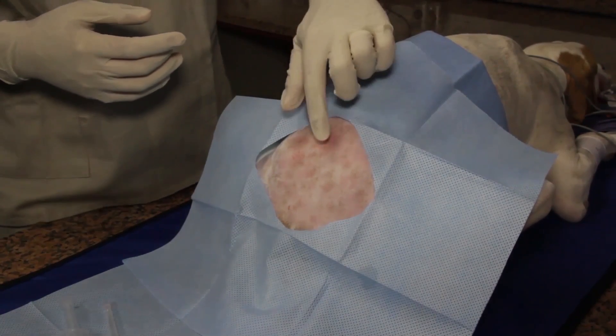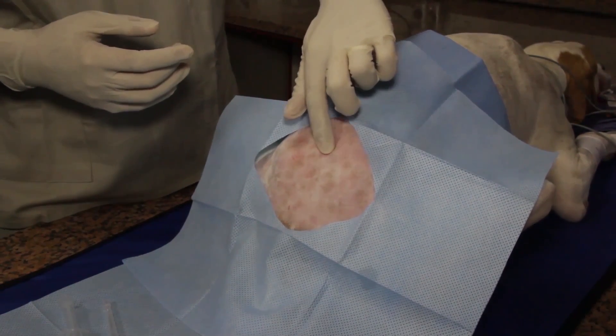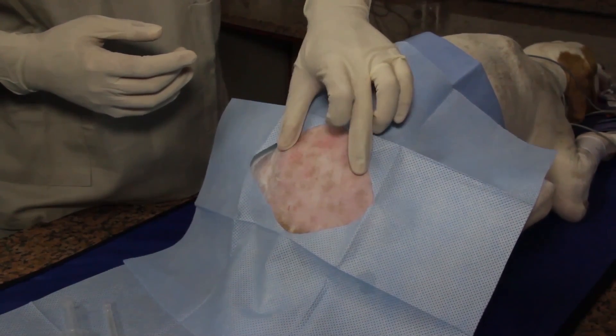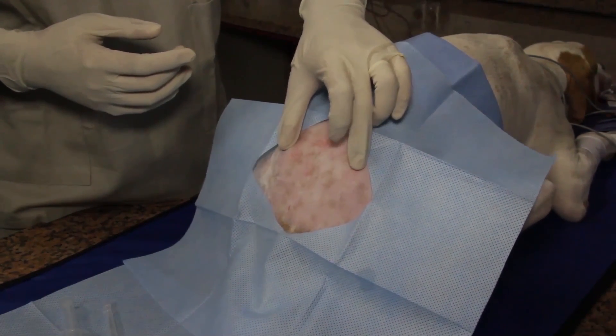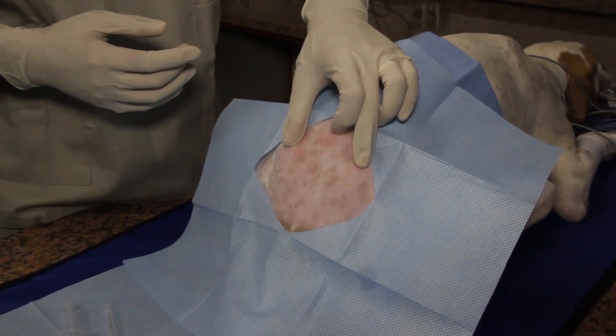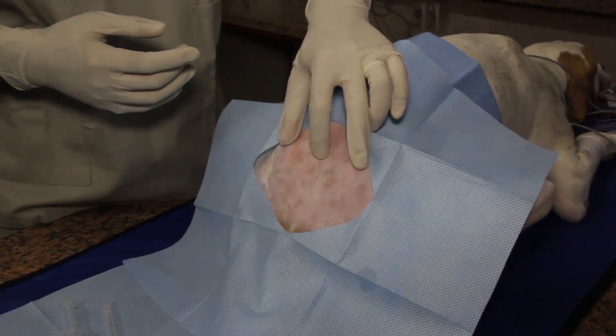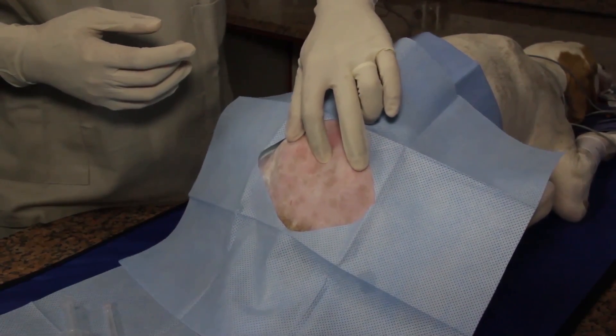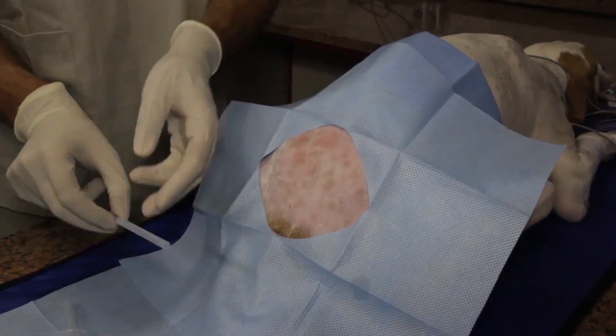The anesthetist has prepared a syringe of local anesthetic that contains a bubble of air. The bubble of air can be used to detect resistance during the injection. With the sterile drape already in place, the anesthetist will palpate the dorsal spinous processes of L7 and S1, as well as the wings of the ilia. The site of needle insertion is between L7 and S1, where the space is the largest between the vertebrae.